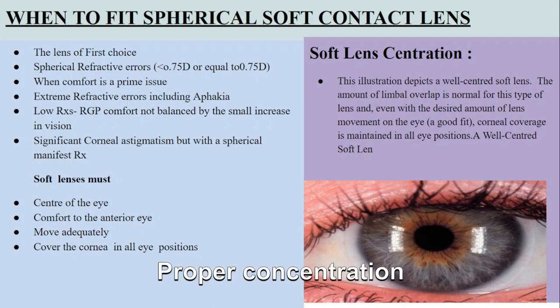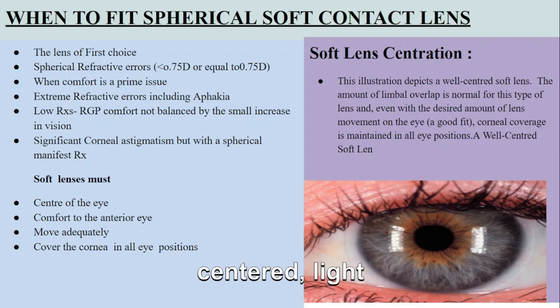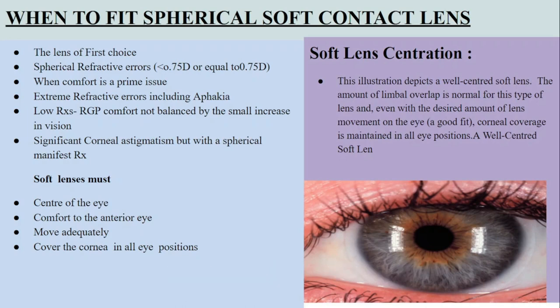Proper centration is important for a few reasons. First, it ensures that the optical center of the lens is aligned with the center of the cornea, maximizing visual acuity. When the lens is well centered, light entering the eye can pass through the correct part of the lens, allowing clear and sharp focus.